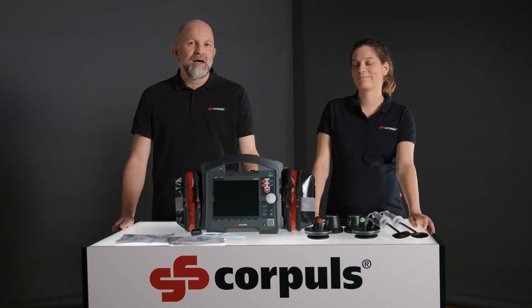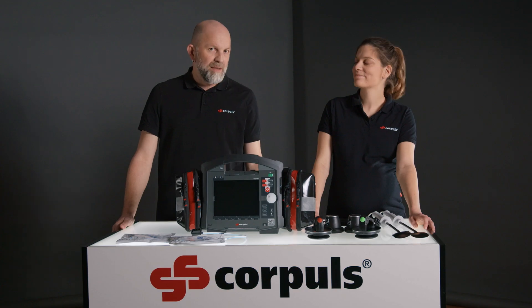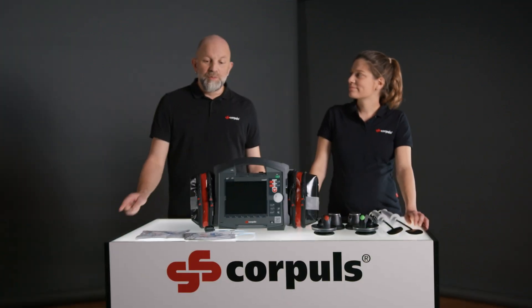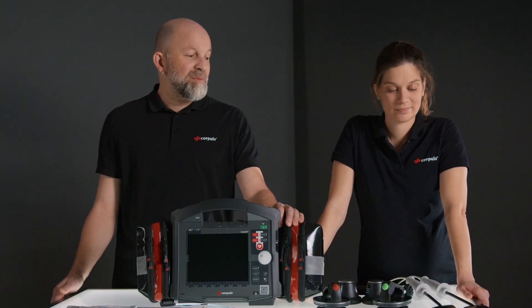With the Corpulse 3 we have two different modes — AED mode and manual mode — in which we have the option to deliver a shock. The shock can be delivered either by the Corpatch Easy electrodes, the shock paddles, or the shock spoons.